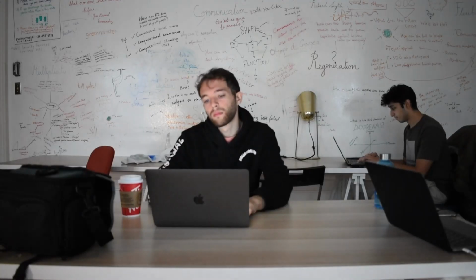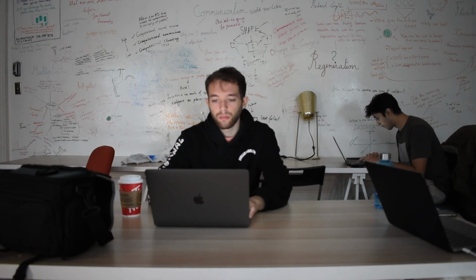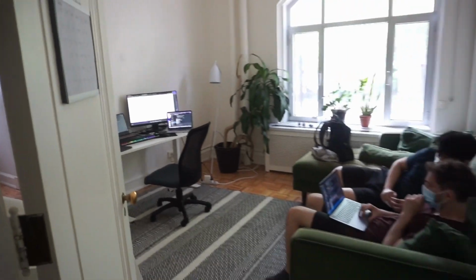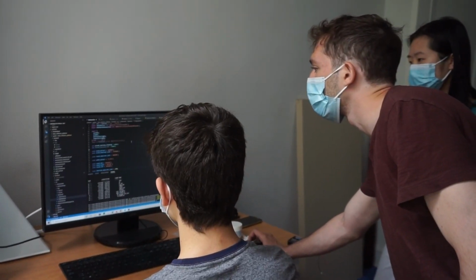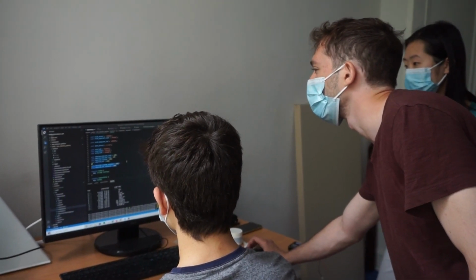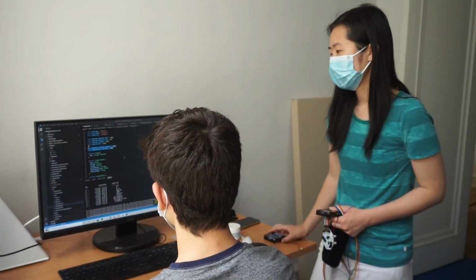The inference platform integrates the work of the machine learning and signal processing teams. The React web app dynamically generates a keyboard layout and collects the data for a certain period of time before hitting the backend endpoints to get the predicted letter and autocomplete recommendations. The main difficulty was with rendering the flashing keys. To get a high enough frame rate, we had to do some profiling optimization to get a smooth sinusoidal signal. And with that, the platform successfully integrates the language model and CCA algorithms to finally display the predicted character on the screen.